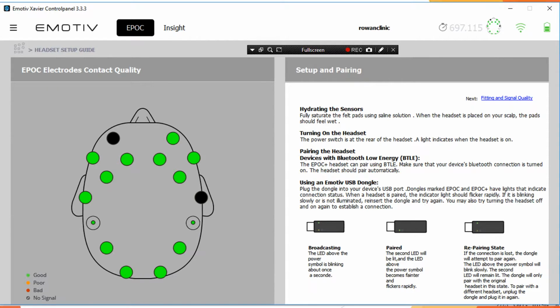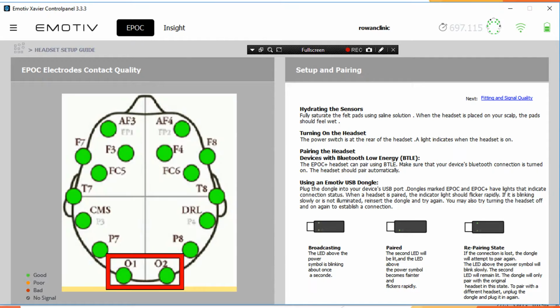This is an electrode map of the headset the Emotiv software provided us with. The electrodes we were interested in were O1 and O2. The O stands for occipital lobe, the brain region in question. This is because we used SSVEP, steady-state visual evoked potential, a phenomenon that occurs in the occipital lobe.